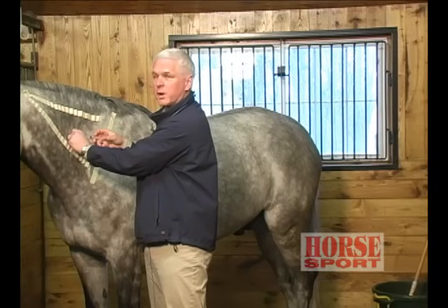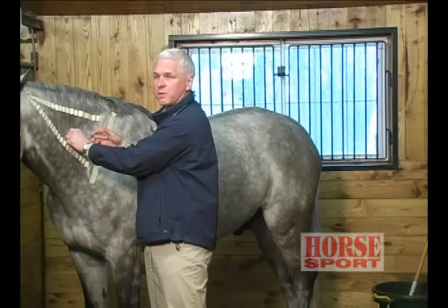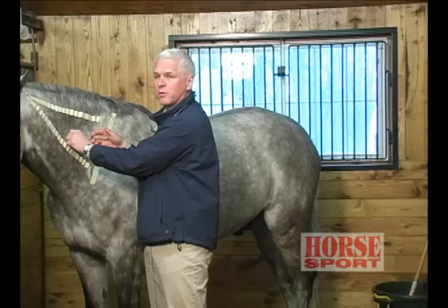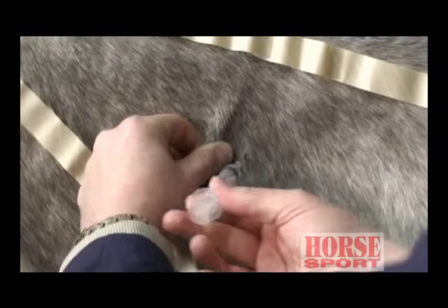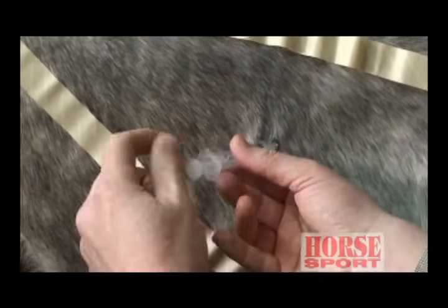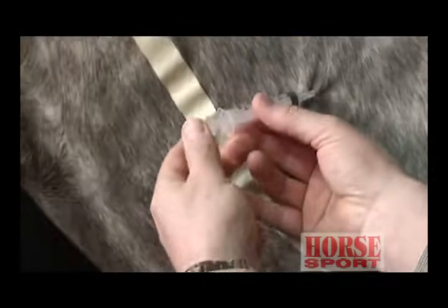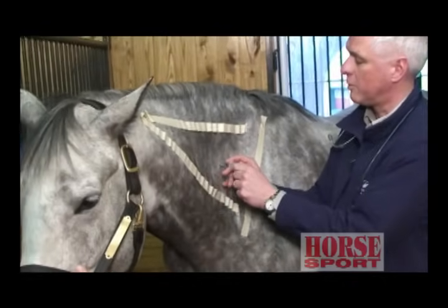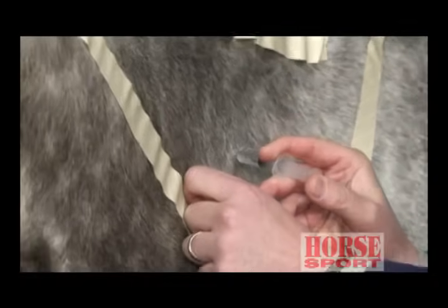Some medications, primarily penicillins, are a large volume, and we want to put those into two spaces. Too much medication in one spot can cause the horse to get very sore. It can also cause an abscess if the volume is too much. So what we'll do is pull the needle out a little bit — not enough to come out of the skin — and redistribute it into another direction. Again, pull the needle back to make sure there's no blood, and then inject your medication.